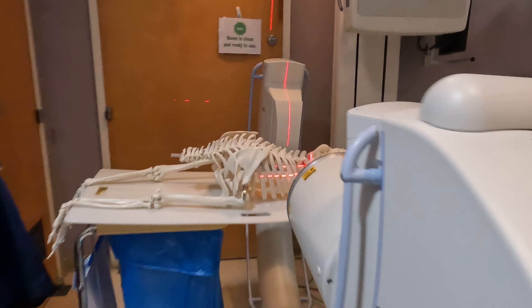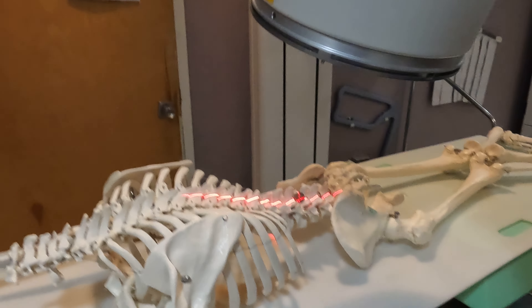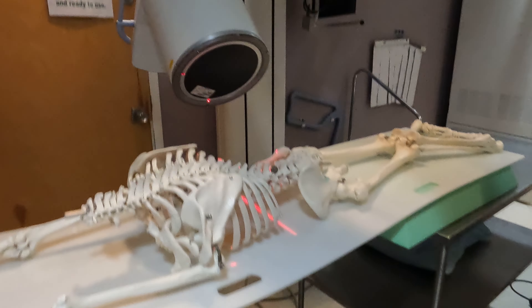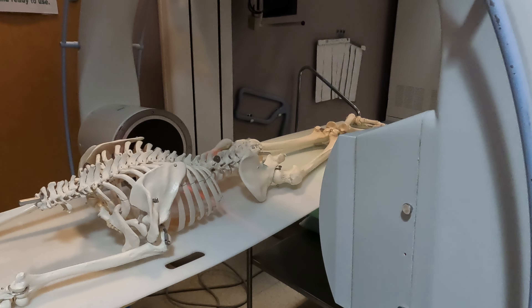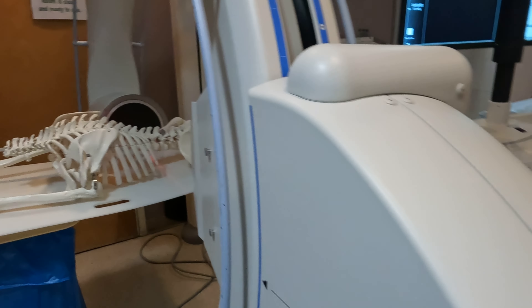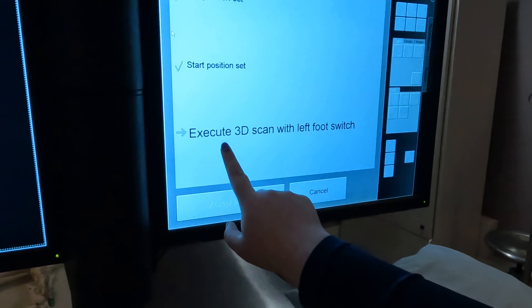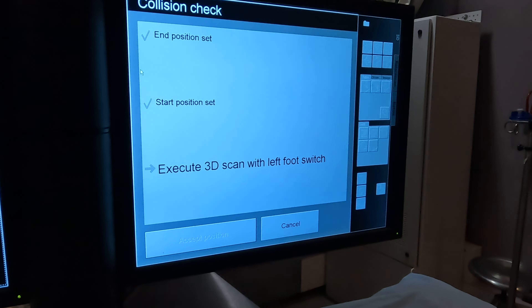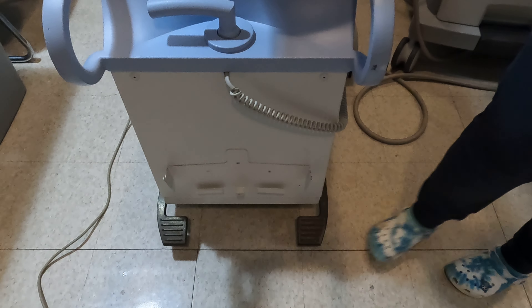You're going to go all the way over the patient, all the way around to the other side. If you let go, it'll stay, and you'll notice that it now says to execute the 3D scan with the left foot switch. From here, make sure the base is locked, because if it's unlocked it could move during the exam, and you don't want that to happen.